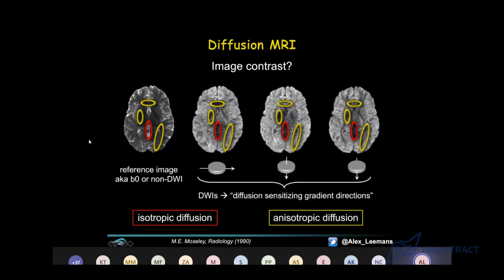If you have many different projections along many different orientations, you can actually see it's a hand. But if you do it in the plane of your hand, you only see a line. You basically see all your fingers on top of each other. But if you have many orientations, you get a better profile of the object that you were looking at.